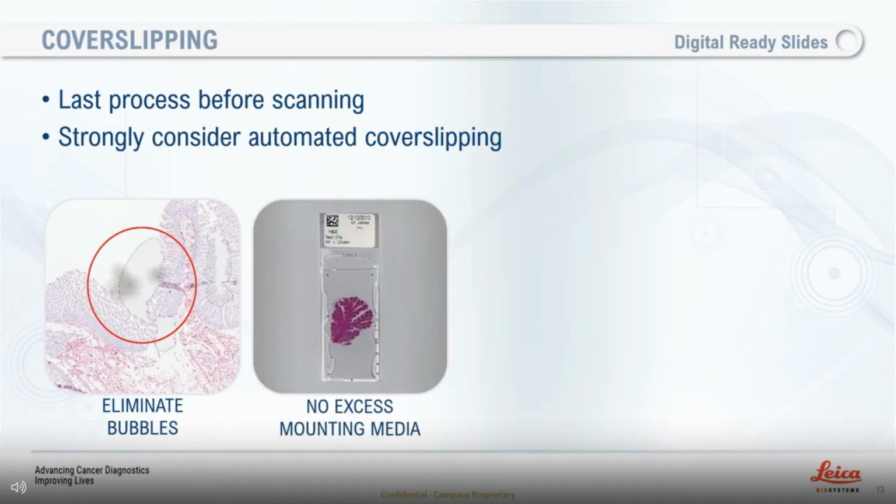The other piece is no excess mounting media. This is quite similar in a lot of ways to the same situation that we had with the sticky labels on the slide. And that excess mounting media has two phases.